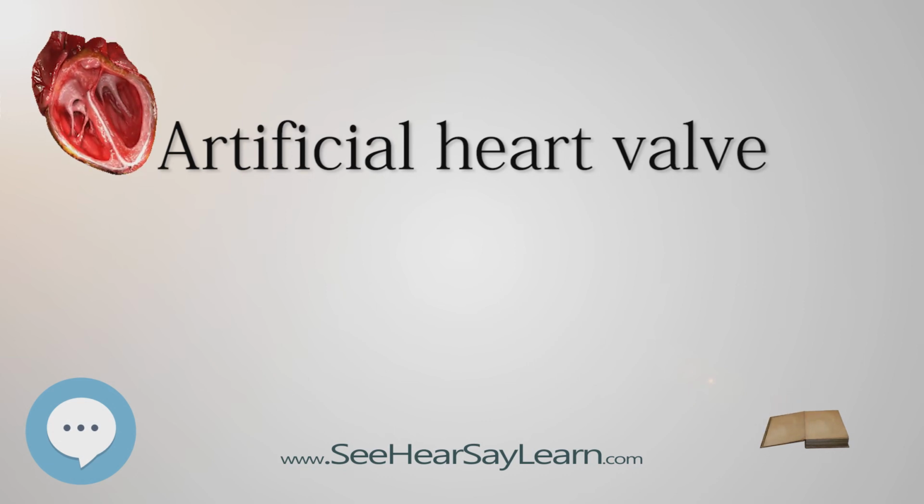Non-thrombogenic. As natural heart valves are lined with an endothelium continuous with the endothelium lining the heart chambers, they are not normally thrombogenic. This is important, as should thrombi form on the heart valve leaflets and become seeded with bacteria, so-called bacterial vegetations will form. Such vegetations are difficult for the body to deal with, as the normal physiological defense mechanisms are not present within the valve leaflets because they are avascular and largely composed of connective tissue.